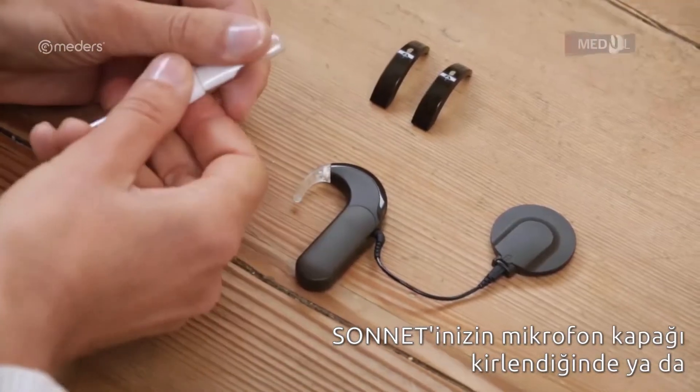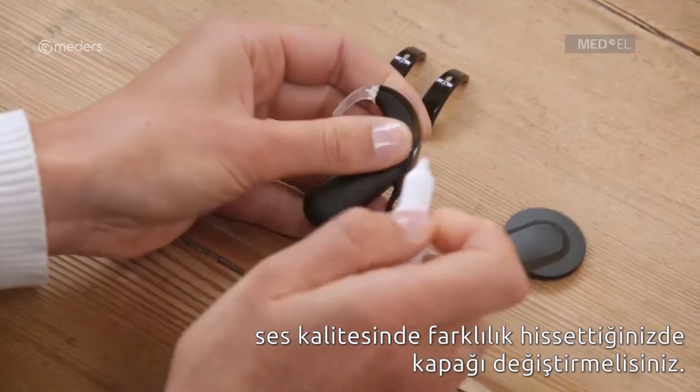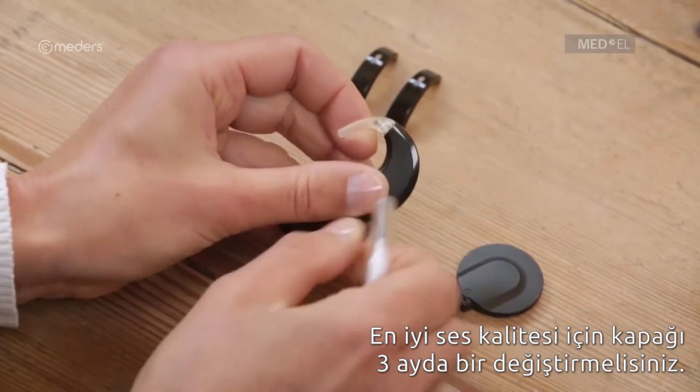You should replace the Sonnet microphone cover if it appears dirty or if you notice a change in sound quality. You should change the cover every three months for the best sound quality.